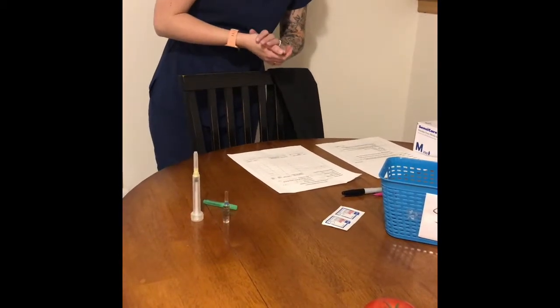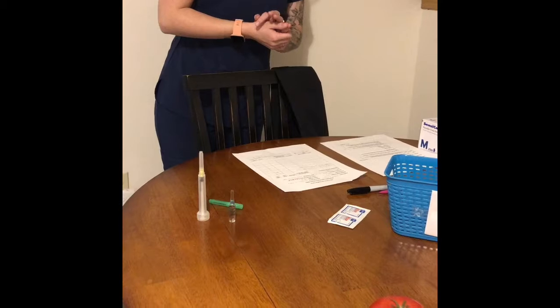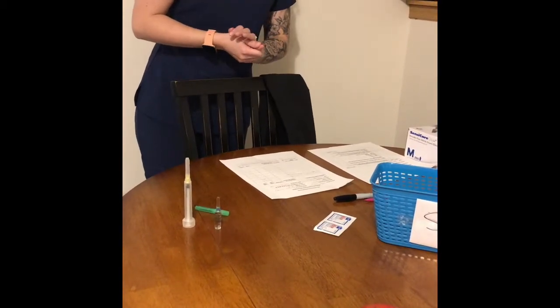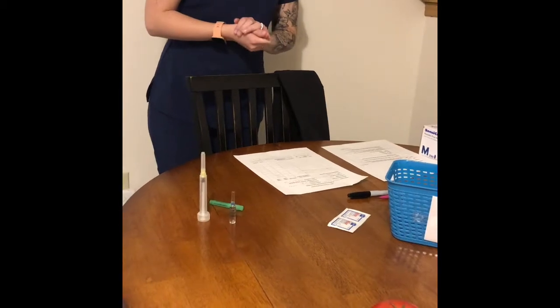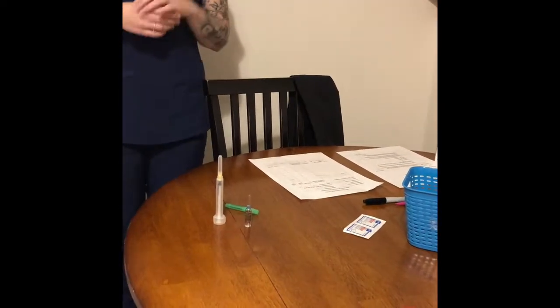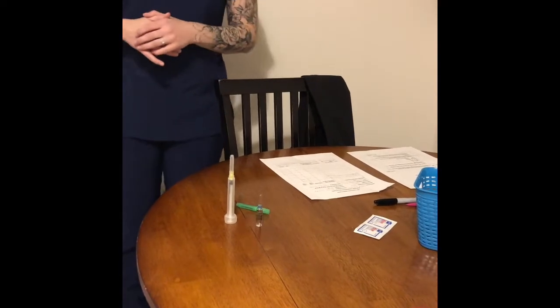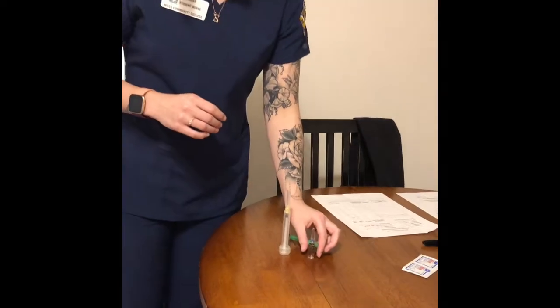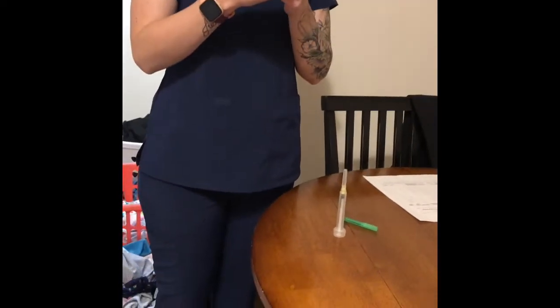He needs a heparin 5,000 units subcutaneous every 12 hours for 3 days. The heparin ampule contains 10,000 units per milliliter, so I'm going to get 0.5 milliliters for my injection. I'm going to come into the medication room and pick up my ampule.